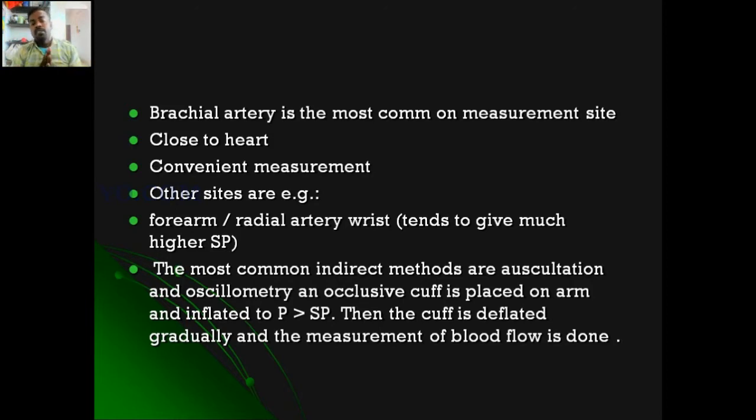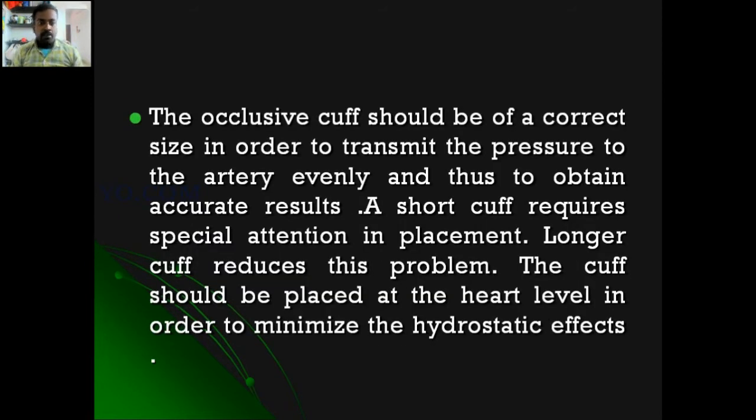The occlusive cuff should be the correct size in order to transmit the pressure to the artery, and thus to obtain accurate results.